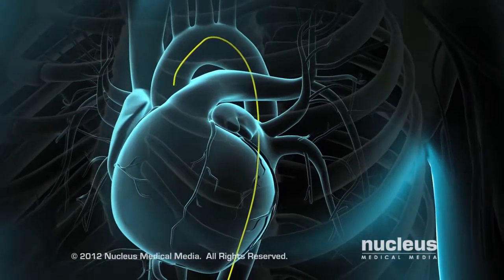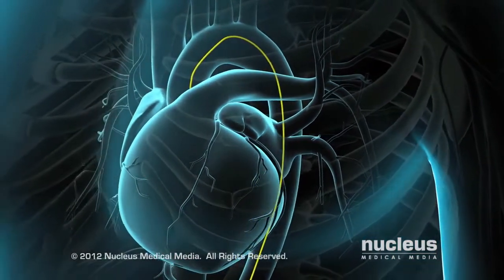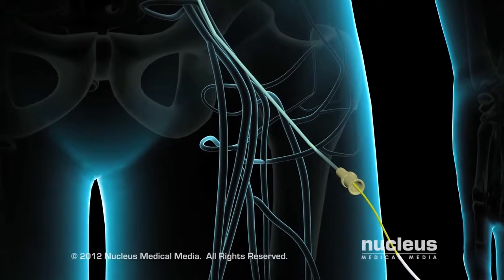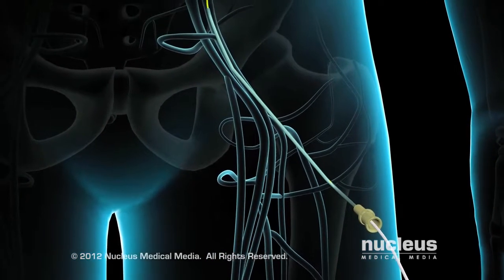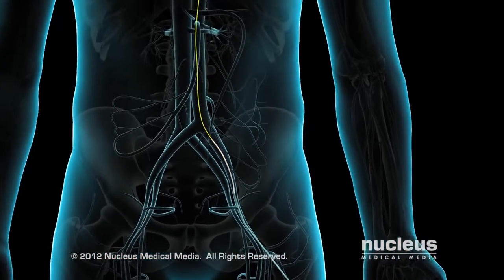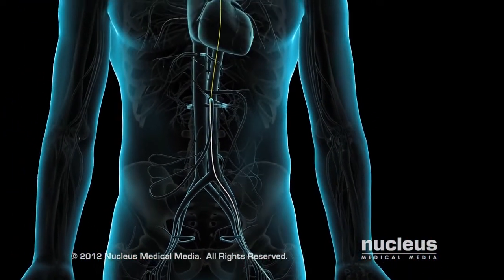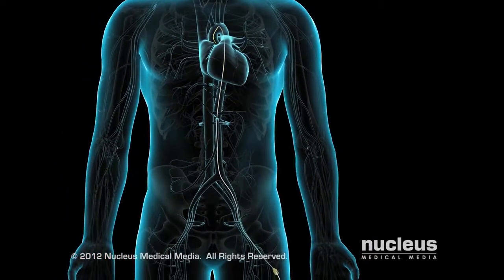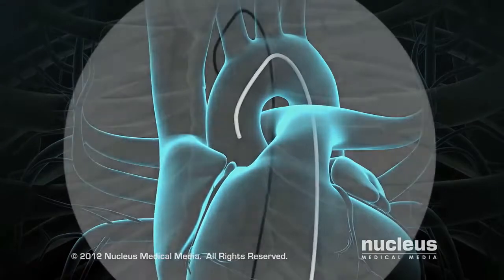to your femoral artery. Next, a soft, flexible catheter will be slipped over the wire through the sheath and threaded up to your heart. Your physician will watch the movement of the catheter on the fluoroscope. You may feel pressure as the wire and sheath are inserted, but you will not feel their movement inside your arteries.